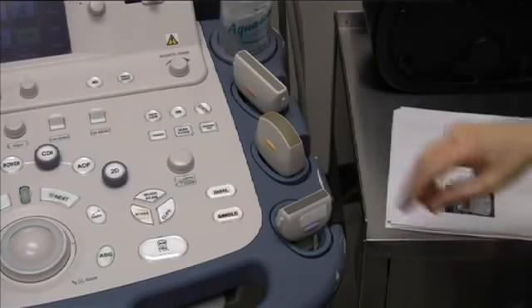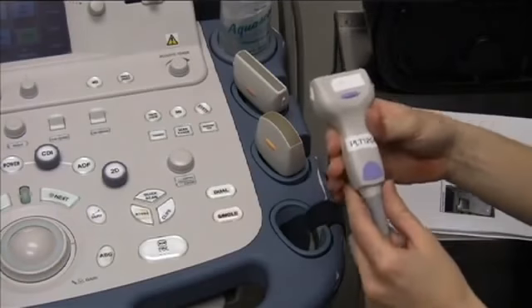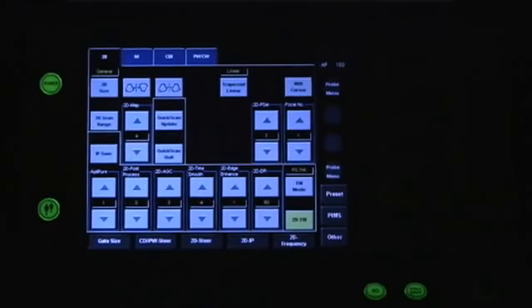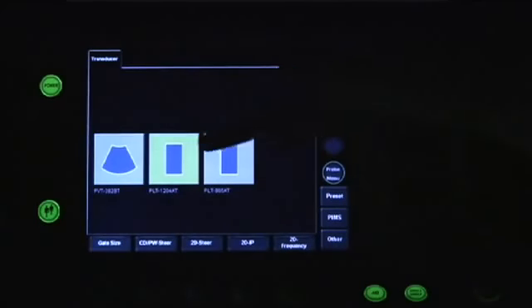To scan your radial artery, we're going to use the linear transducer. To change to this transducer, press Probe Menu on the touch screen and then select this transducer by touching it on the touch screen.